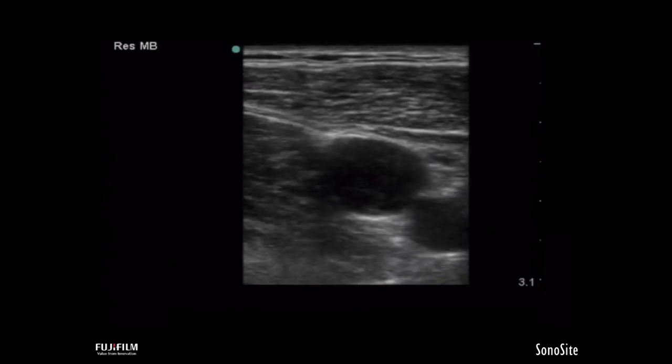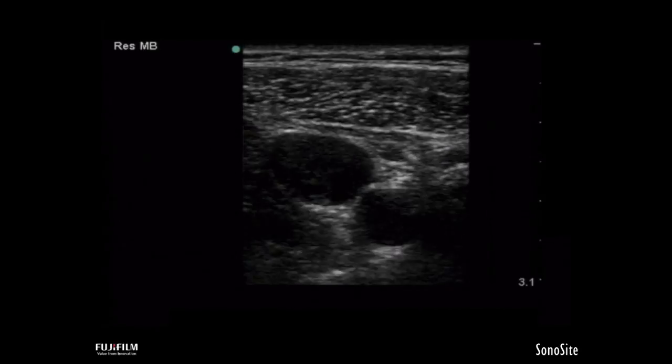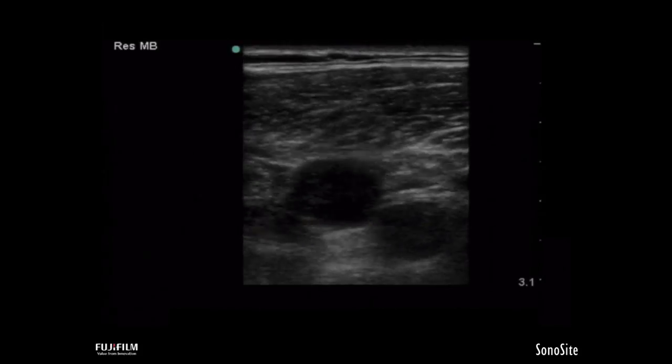If you suspect a PE, especially if you see an enlarged right ventricle, it's also great to add in a quick scan for DVT looking for clot. You can do this using a 2-point compression technique in the femoral and popliteal veins.